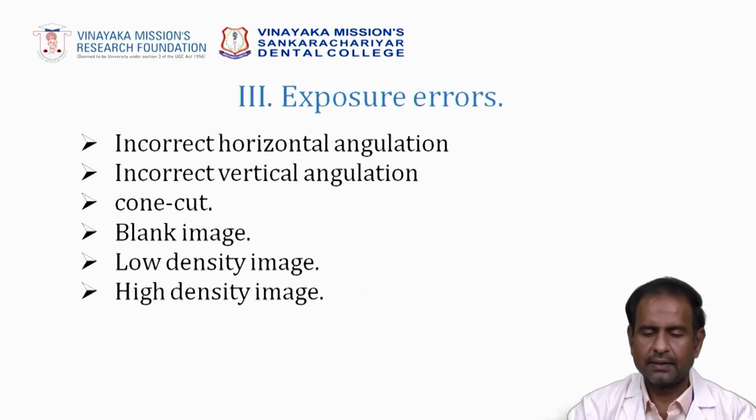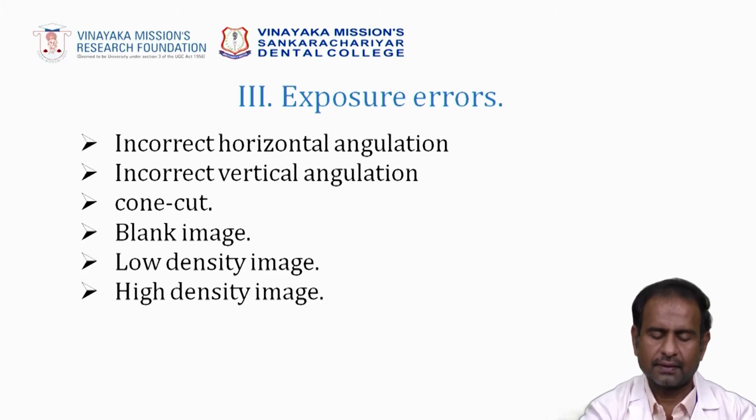Exposure error. In this category, there is incorrect horizontal angulation, incorrect vertical angulation, cone cut, blank image, low density image or light image, and high density image or dark image. These are all the errors during the exposure time. So we will see them one by one.